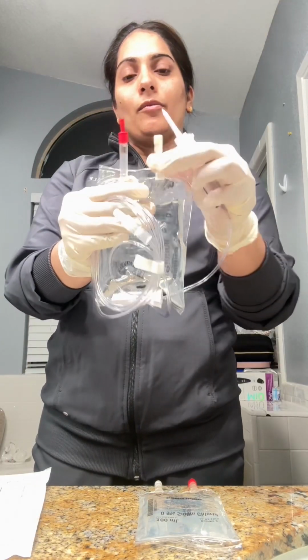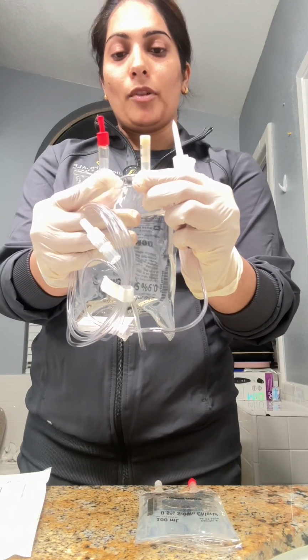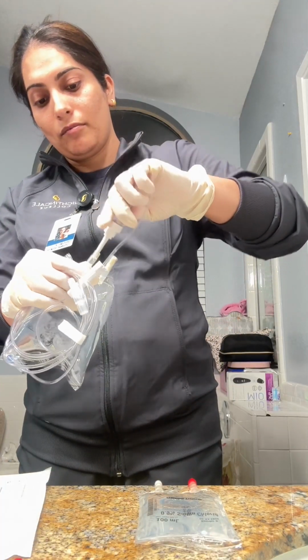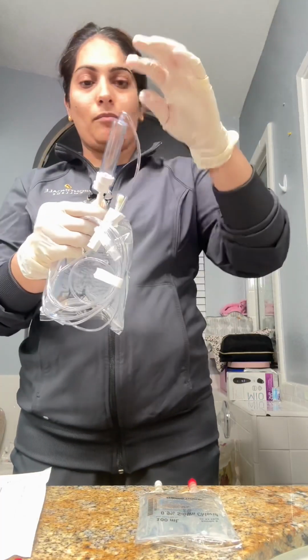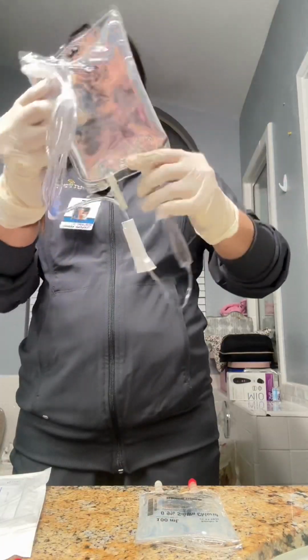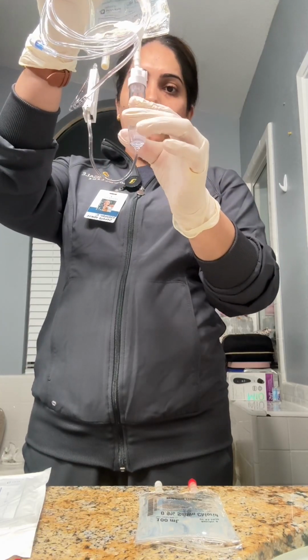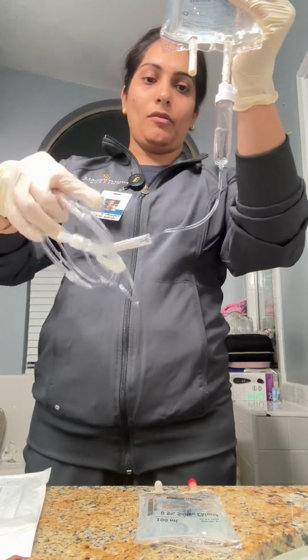Oh, and this one right here is where the medication goes, and this is for fluids. Spike. Prime right here. There we go.